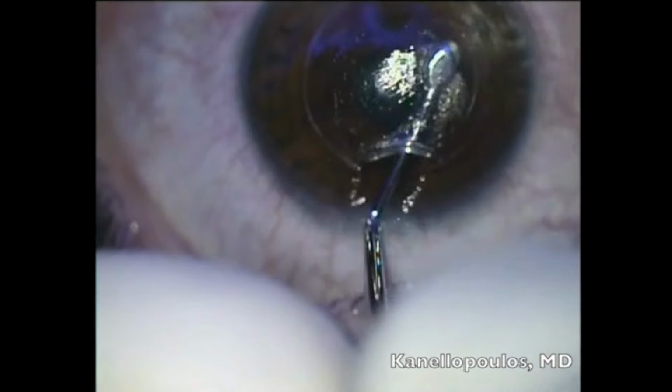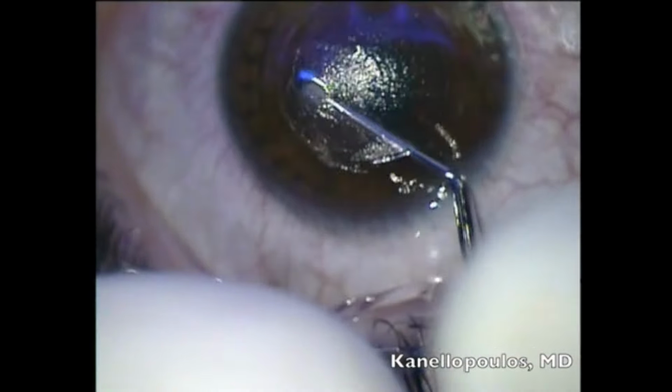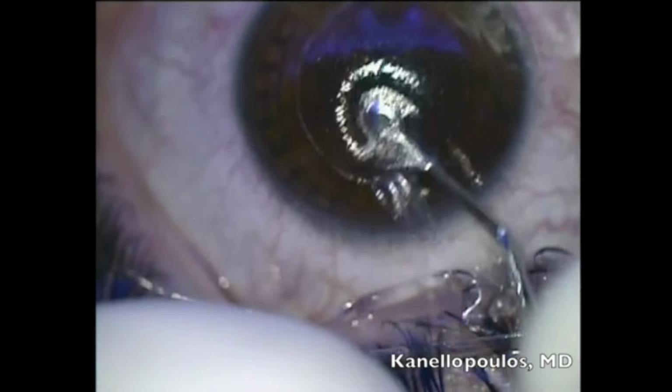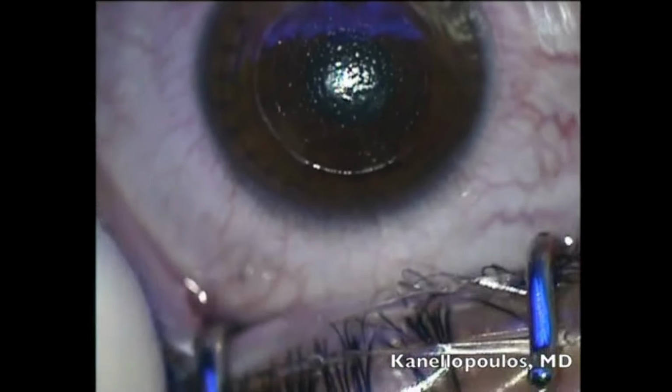I'm removing it, and we're seeing the same process in the other eye. Final movements, and as you can see here, the lenticule is out. I'm trying to avoid using a second instrument, and what's impressive is the procedure's done. Patient has very, very low discomfort.